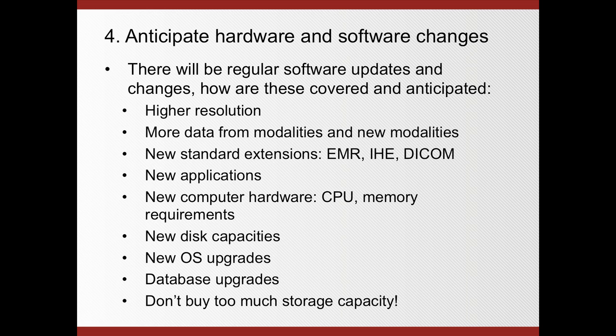So new standard extensions such as the electronic medical record and IHE DICOM will come along. And then also new applications. There might be a new fusion of modalities, MRI PET for example. So new applications require upgrades and changes to facilitate them, not only of the PACS system itself, but also of some of the plugins. If you're using speech recognition today, I'm sure that will be upgraded as well.